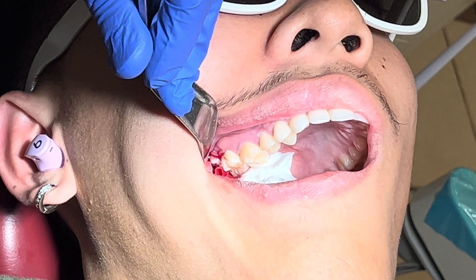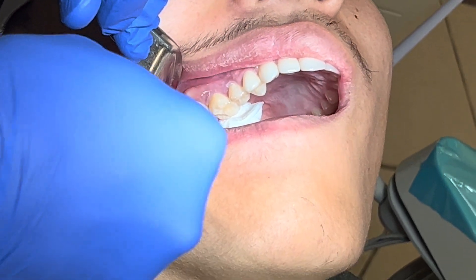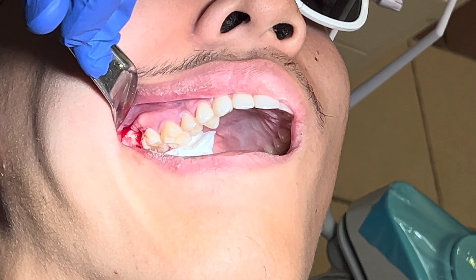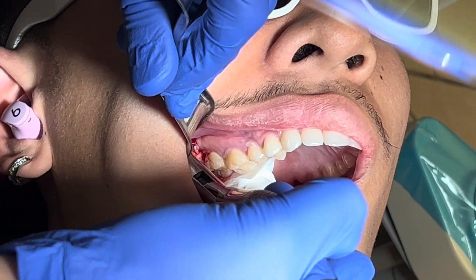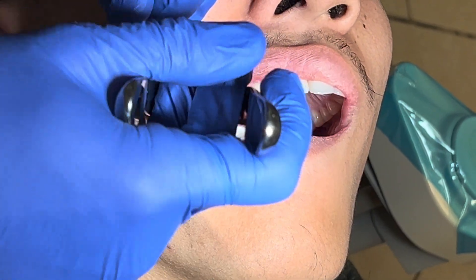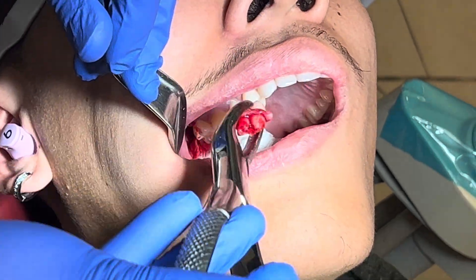I'm going to release a little bit more — you can see it come loose. Be careful: if you're not careful, the tooth will go into the patient's throat, so you want to be very careful here.